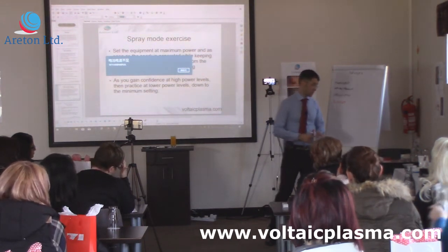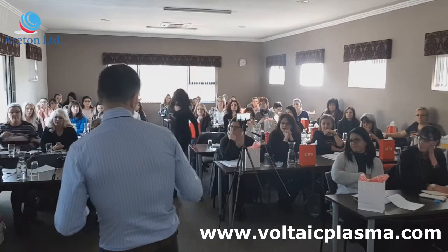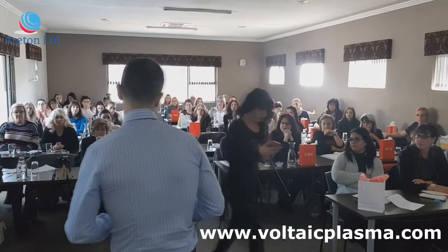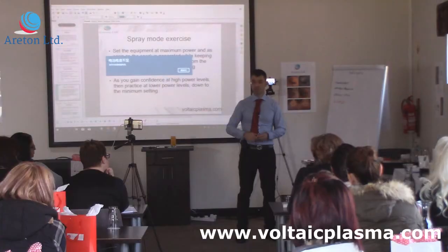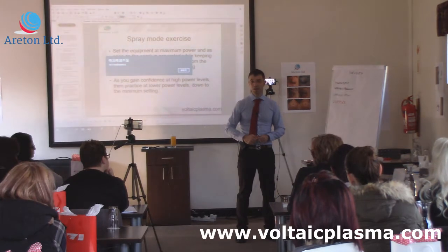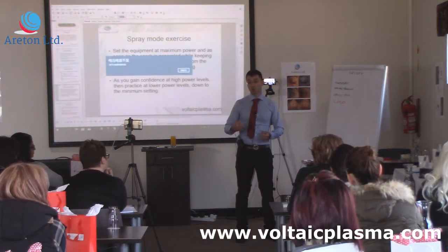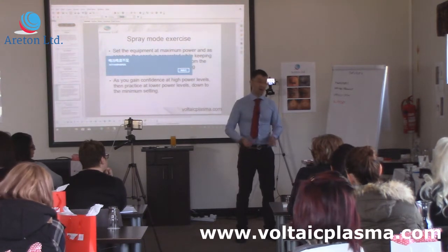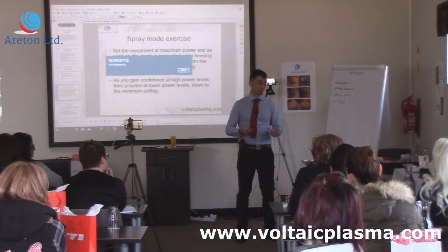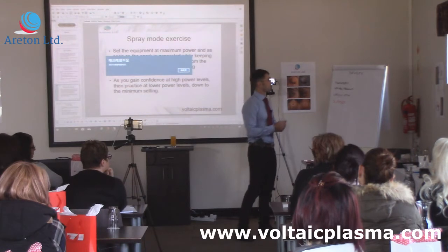This particular blue device has got 32 power levels. You can get a car that goes from 0 to 100 in 6 seconds, 7 seconds. Get one that goes in 3 seconds, 2 seconds. Buy the latest Tesla in 1 point something seconds. It depends what you want to do with it. It really depends what sort of backup you're getting, what features you're getting. Say, for example, I made this graph here. I'll give you an example.